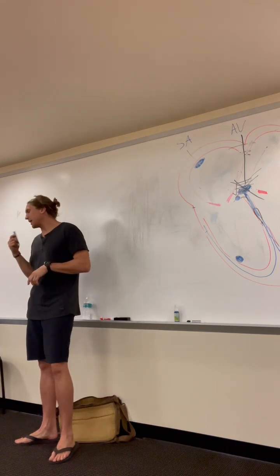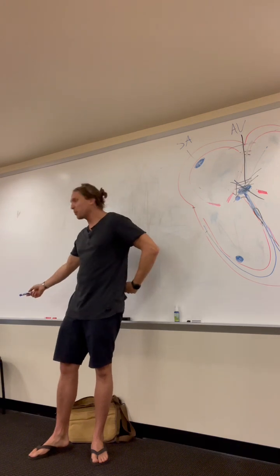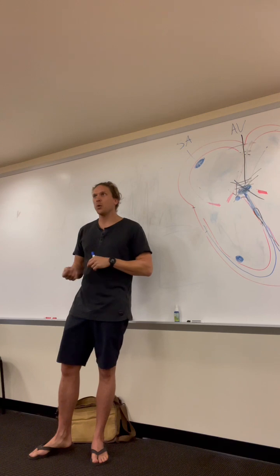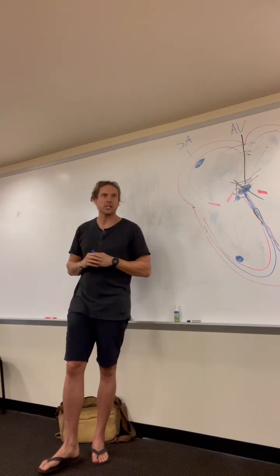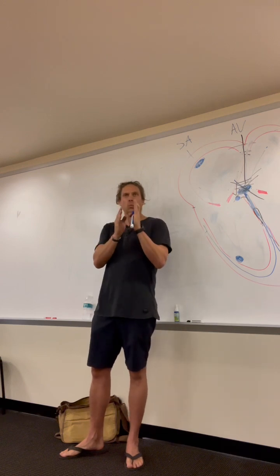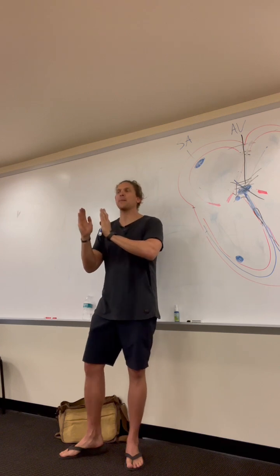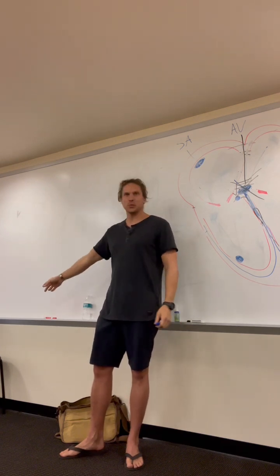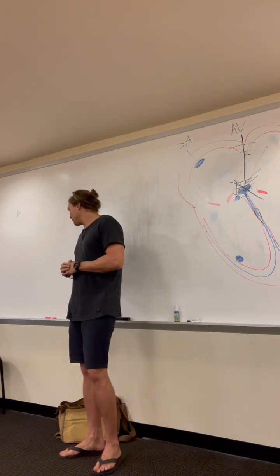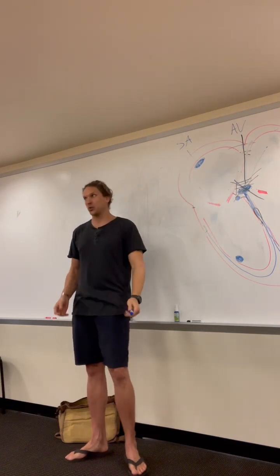You guys might also find as you're doing this that some of the P waves are in QRSs, and in that case, they're pretty easily identifiable when you use this paper method. To confirm this, you'll also do this paper method with your QRS. So find 2 QRSs, take a separate piece of paper, draw little marks from one QRS to the next QRS, slide that piece of paper over, and your next QRS should line up. This one's easy because it's pretty obvious that the QRSs are the same distance apart. Just keep in mind that P waves can be hidden. So it's complete disassociation between the atria and ventricles, your 3rd degree heart blocks.